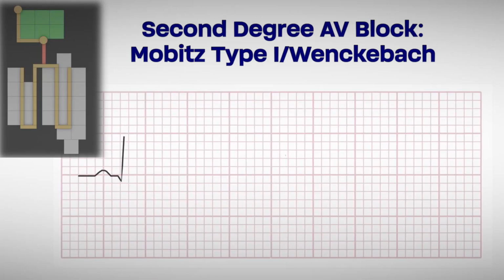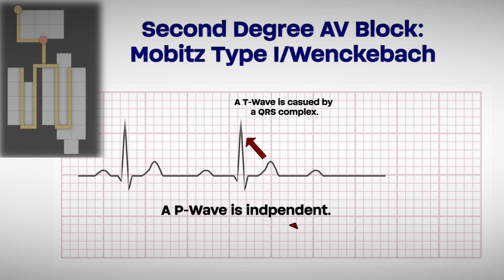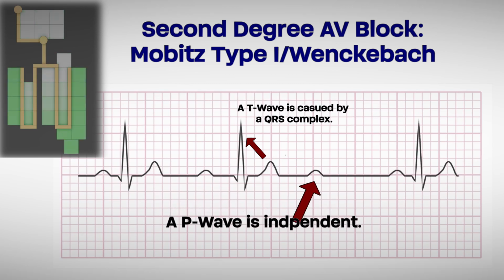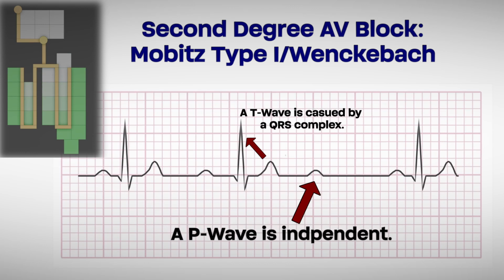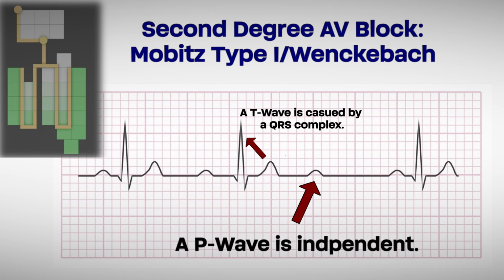A P wave can exist by itself. A T wave, or I guess a U wave, which can sometimes look like a P wave, can't, because they're directly tied to ventricular depolarization. So they can't exist without a QRS complex preceding them. So a random displaced wave that looks like it could be a P wave almost certainly is. And this can be one of the signs of AV, or in extreme cases, ventricular dysfunction. The signal isn't causing the ventricles to depolarize for one reason or another.